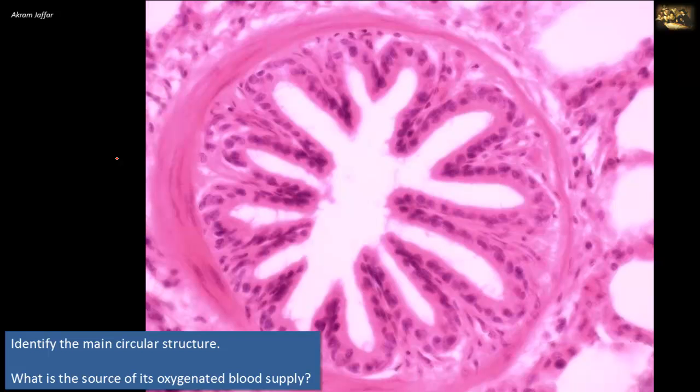Identify the main circular structure. What is the source of its oxygenated blood supply? In this respiratory tube, there is no cartilage in the wall, so it's not a bronchus. It cannot also be a trachea, especially since it is here surrounded by alveoli of lung tissue, so it is inside the lung and can by no means be a trachea. It is a bronchiole. Bronchioles measure 1 millimeter or less in diameter, and the epithelium gradually transforms into a simple ciliated columnar epithelium like the one that we see in here.